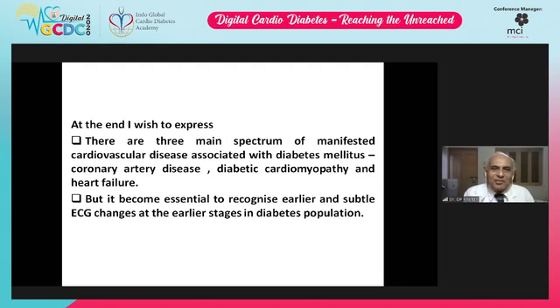And the QRST angle. The QRS axis is the ventricular depolarization axis, and T is the repolarization axis. Normally, the interval between the two, in terms of degrees, is 45 to 60 degrees. If the interval becomes prolonged, what does it mean? It means that the ventricular repolarization is somewhat lagging behind the ventricular depolarization, and this lagging behind may keep the ventricular myocardium somewhat in an active stage if there is a predisposition to ventricular arrhythmias, or ventricular arrhythmias may develop de novo at times. So this is the significance. So the QTc interval and the QRST angle differences, more or less they denote the same things for the purpose here. So it's very important to be understood here.